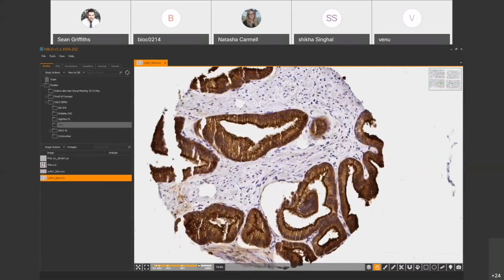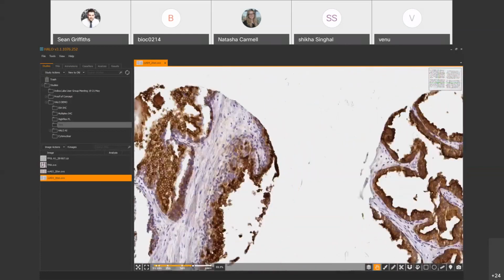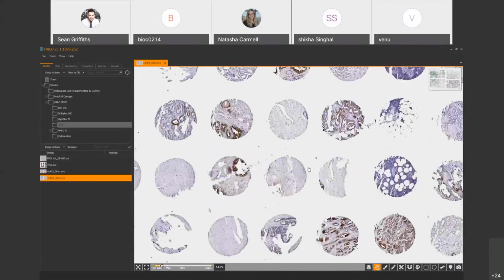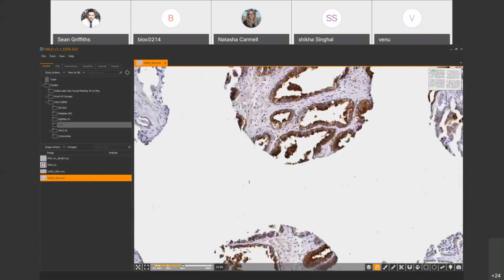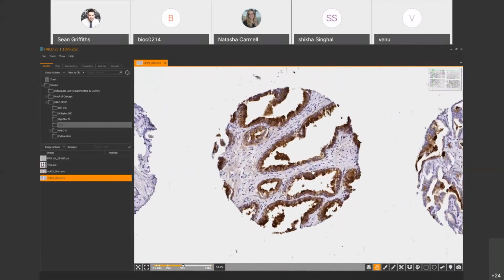You can see here some differences in staining intensity, background, and nuclear morphology. You'll see differences across the array. For that reason, if you are doing TMA analysis, I would recommend as a starting point to do an area-based assessment of the stain. That's one of our tasks for today: area detection or area quantification. So we'll loop this requirement into the TMA overview. We're going to first do an area detection, detecting the positive area for each of the stains.